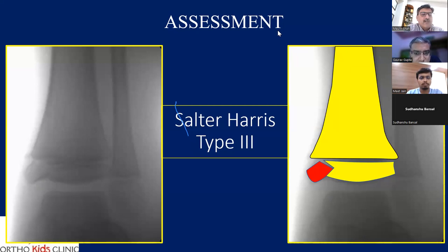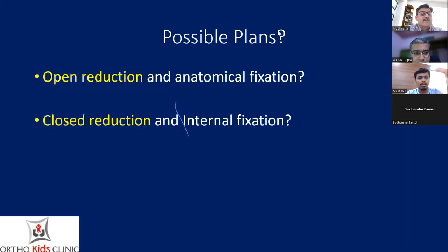So, what if you are not able to achieve a good closed reduction? Then of course you should not hesitate to do an open reduction, right? Yeah. So let's see how it went. Actually, this is more displaced than what it looks here. Meet, show what we have done.